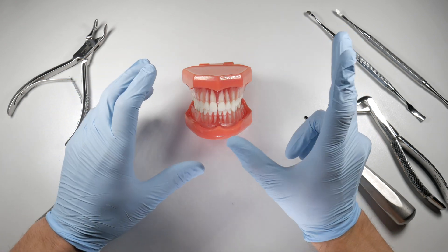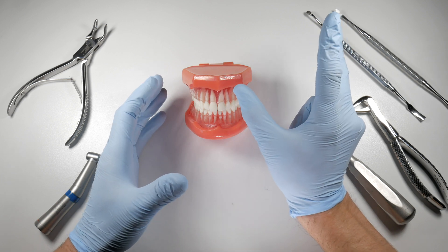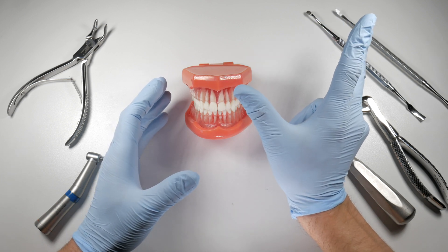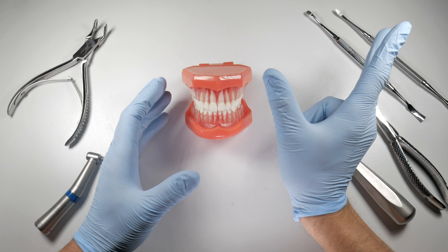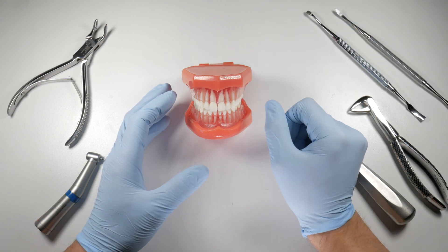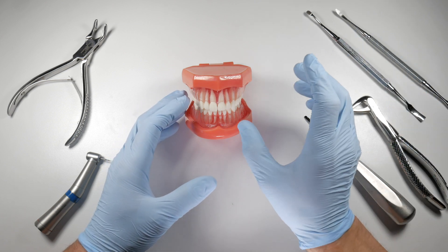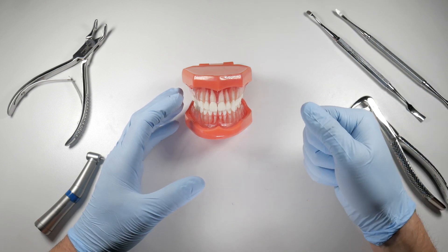Another cause is a divergent root structure. For example, with an upper first molar, the roots may be facing far away from one another. There is no common path of withdrawal among all those roots — the only path is through the buccal plate, and you will experience that if you try to force that tooth out of the socket.